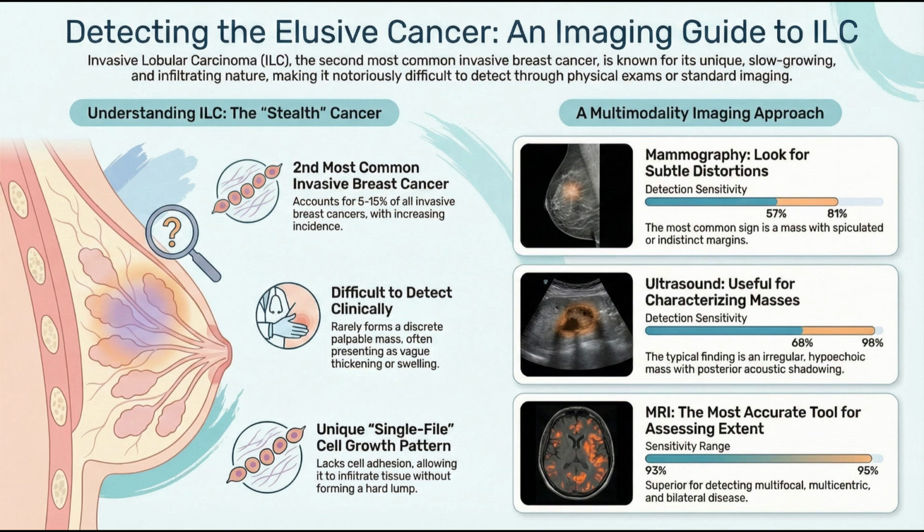Welcome to the Deep Dive, where we unpack complex sources to give you the essential knowledge fast. Today, we're diving into a topic that is, well, notoriously difficult to diagnose: invasive lobular carcinoma, or ILC. We're drawing from a really comprehensive imaging primer published in RadioGraphics, and it's a phenomenal guide to understanding this very subtle form of cancer. And our mission today is pretty laser-focused.